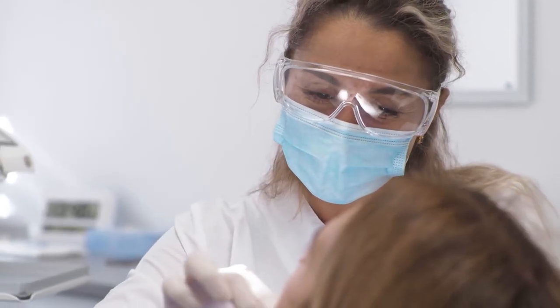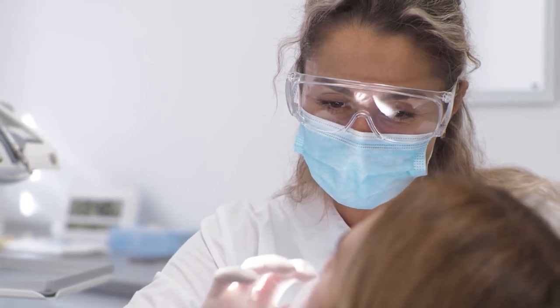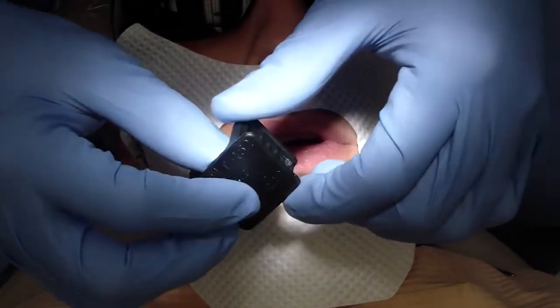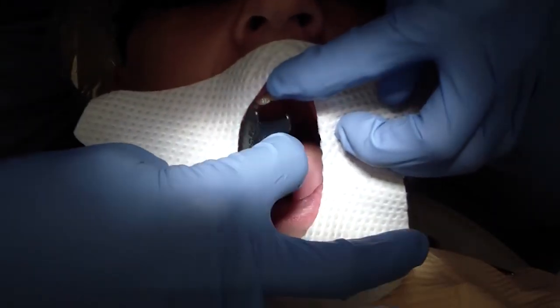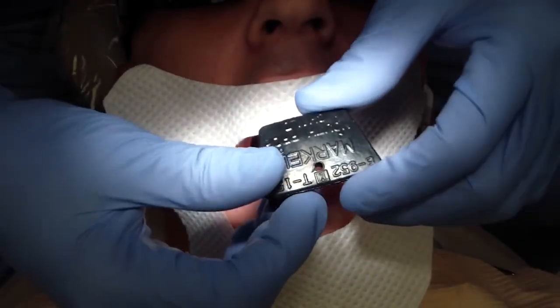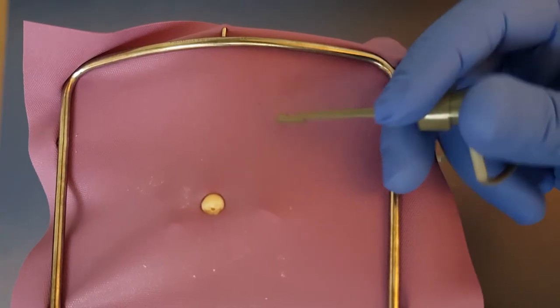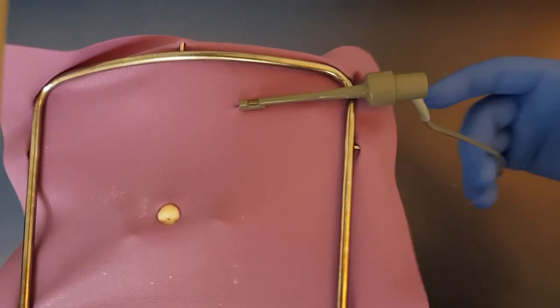So our fifth and final tip is to use the things around you wisely. Endo takes long and patients have to keep their mouth open for a very long time, and the worst thing is constantly having to ask your patient to open their mouth wider. So give them a mouth bite prop to bite on throughout the endo — it makes it so much more comfortable for the patient as it gives them something to bite on and their mouth won't slowly close every other minute. Another thing to use around you is your rubber dam. Instead of constantly handing back the apex locator tip to your nurse when checking for working length, just clip it to the rubber dam, adjust the file, and then just pick it back up.